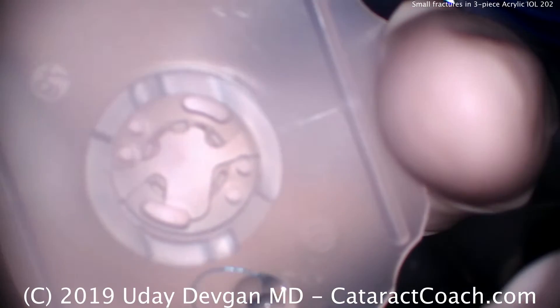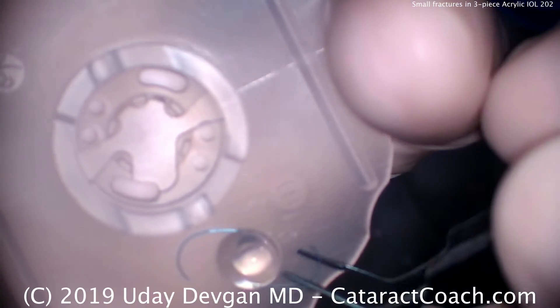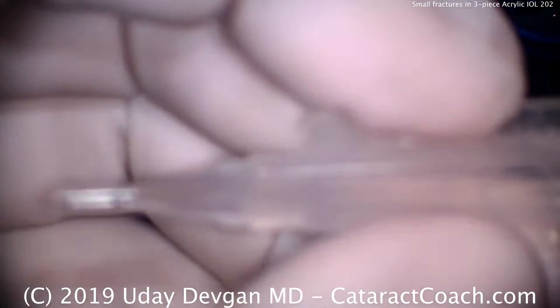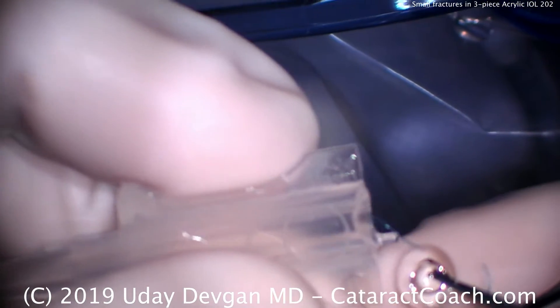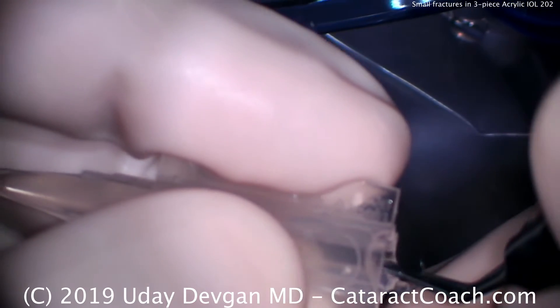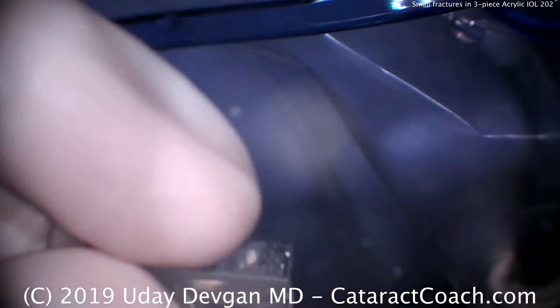We'll watch the whole video of this. There's the three-piece lens. We're holding it very gently with non-toothed forceps — we're not going to leave a mark. Leading haptic going in. There comes the optic — goes in there fine. Pushing it down. Trailing haptic over that peg. This is the correct way of doing it. That looks good.